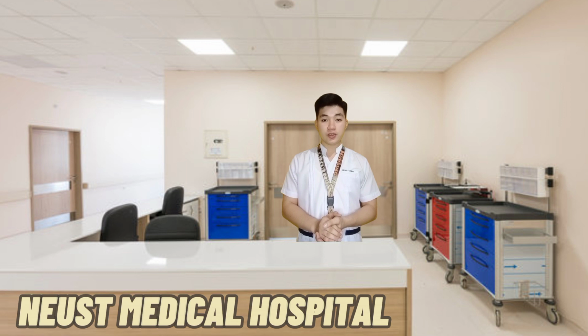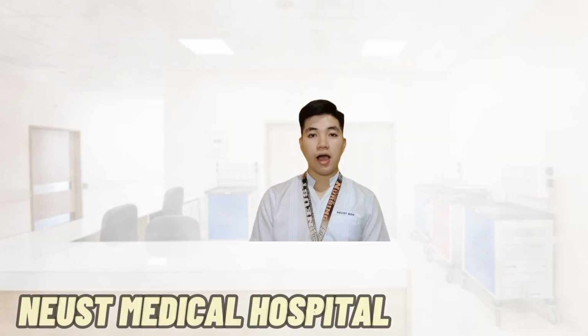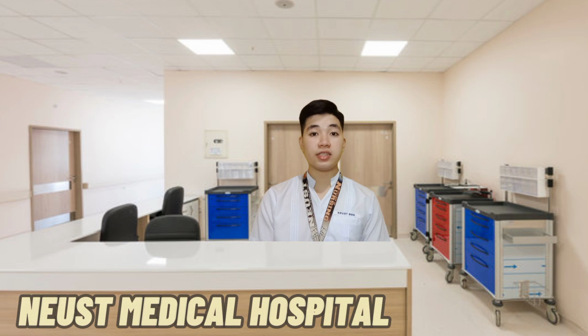And for today's video, I will demonstrate administering of oxygen by nasal cannula. Our goal here is for the patient to exhibit an oxygen saturation level within acceptable parameters.